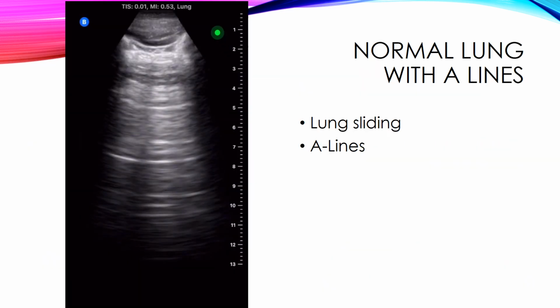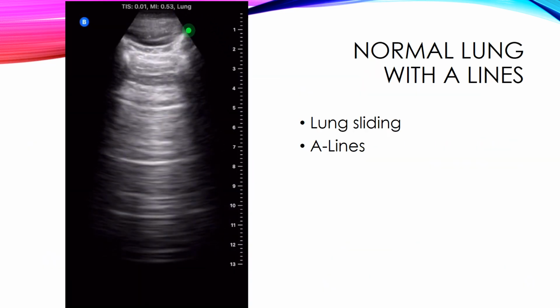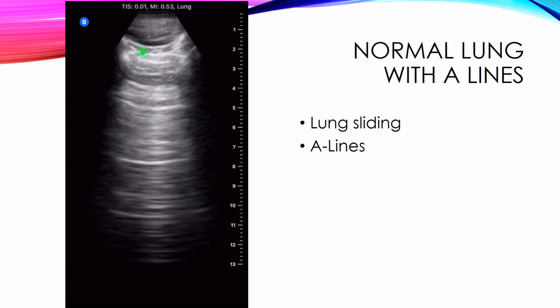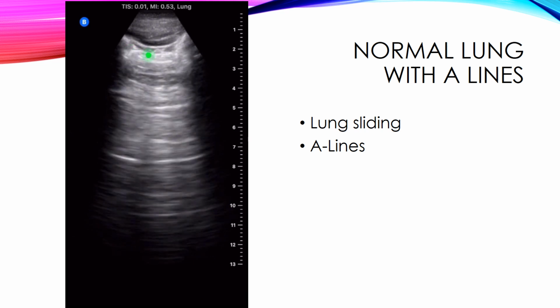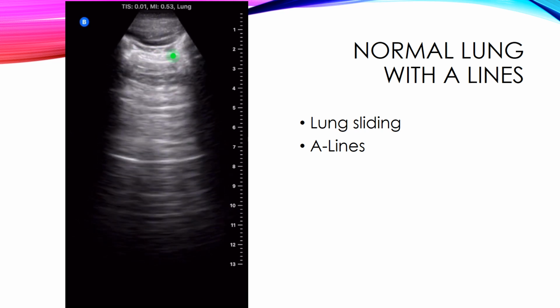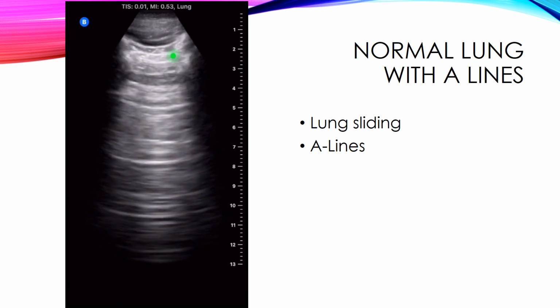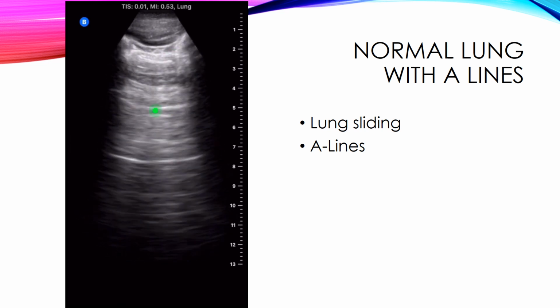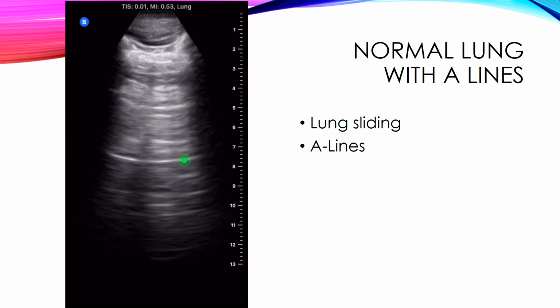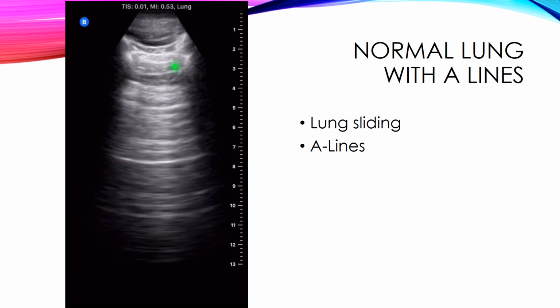This is a lung ultrasound. We are in a lung preset. This video shows a rib and shadow, and an adjacent rib and shadow. You'll see nice lung sliding and A lines. This is the pleural line with nice continuity, and sliding, indicating the absence of a pneumothorax at this level. And we see regularly spaced hyperechoic bright horizontal lines, which are A lines. These indicate reverberation artifact from a normal air-filled lung.